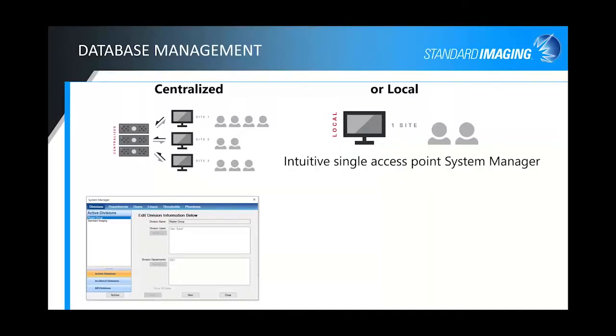The nice thing about PIPSpro is that it's scalable. It gives you the ability to set it up for large enterprise systems, or even just single-LINAC facilities. We have what we call a system manager, which allows you to set up what we call a division, and that division can be some overarching group, say, here in the States, like 21st Century Oncology or Genesis Care, as it is now.